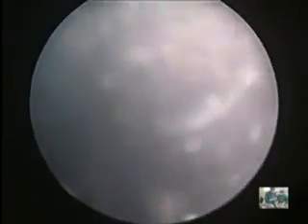Let's have the surgical overview rather than the endoscopic picture. Sham, we're just going to get a good look at you before you finish up. We've done a study to see what the incidence of lip anesthesia and teeth anesthesia is with the canine fossa approach, because we use it a lot. And the incidence of anesthesia in the post-operative period is 30%. So it's very high. So we warn our patients about that.